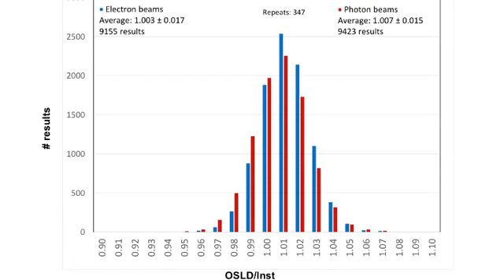Now, there are other systems for output checks as well. There's one run by the IAEA and so on, but to my knowledge, this is the most active one in the world right now.